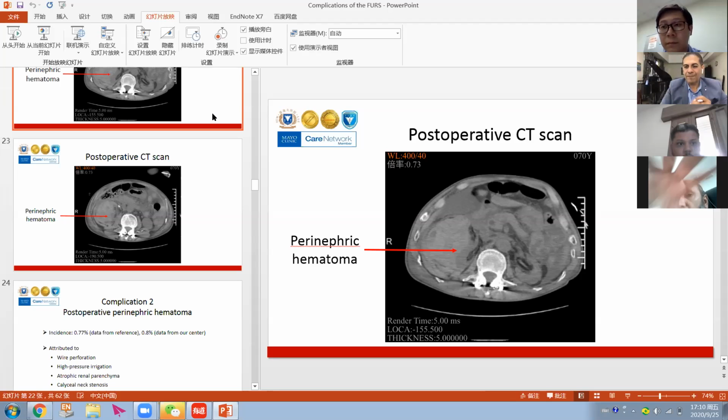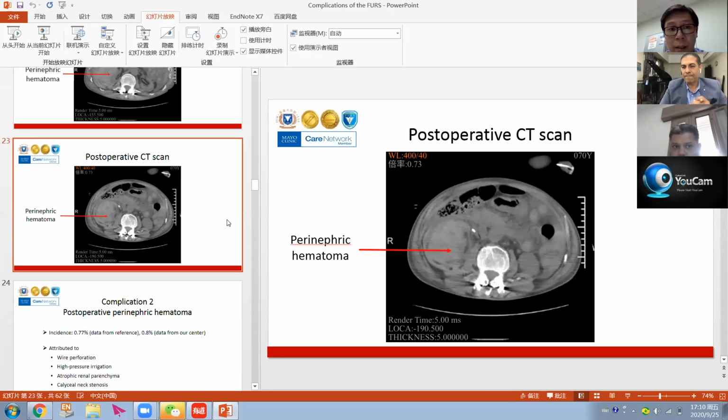Yes, Professor Farahat. Thank you very much for all. I ask about the ideal time for the procedure. What is the maximum duration for the flexible procedure? Yes, I have mentioned in my presentation. In our center, the maximum lithotripsy time is 2 hours. If we use the holmium laser to do the lithotripsy over 2 hours and the stone is still there, we will cease the procedure and do a secondary surgery after a couple of weeks.